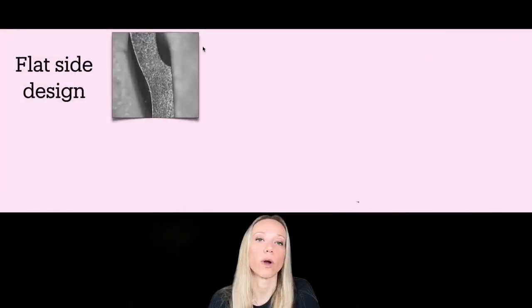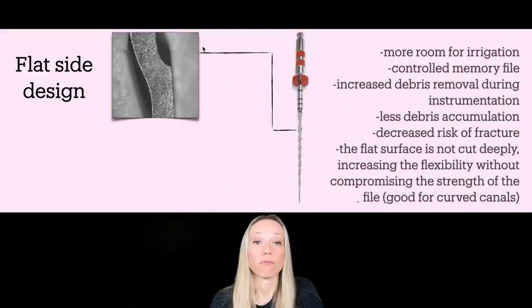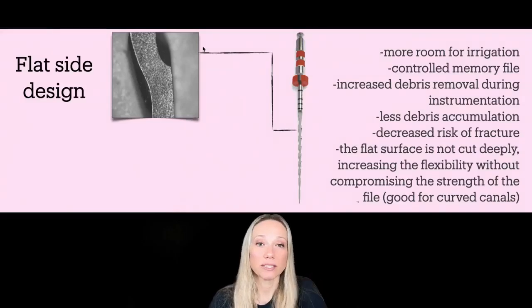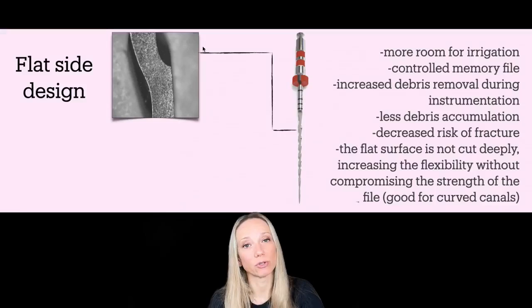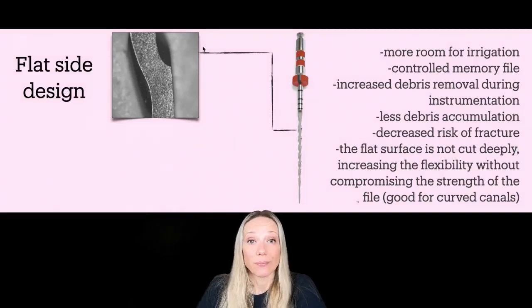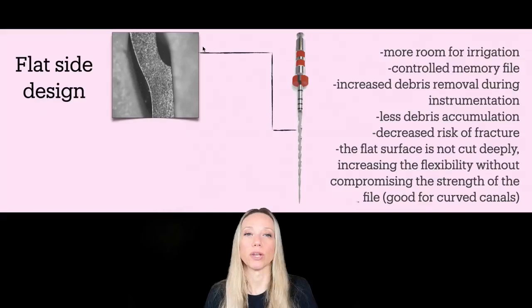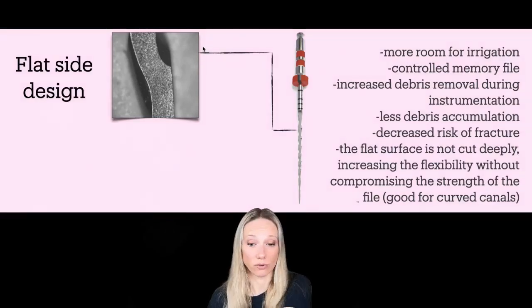Why is this so important? Why can the flat side design be interesting in a file? Well, first of all, because with this kind of design, we have more room for irrigants because the volume of the file is smaller. And also, we increase the possibility to remove the debris during the instrumentation because there is more room to make the debris come out coronally, because these files have to be used in a continuous rotation. And so the file rotates and the debris come up, up, up, up. And then we also have less debris accumulation on the spires. The file is thinner, so it becomes more flexible. But this cut is not very deep, so it is flexible, but the fact of having this flat side design does not increase the risk of fracture for the file.